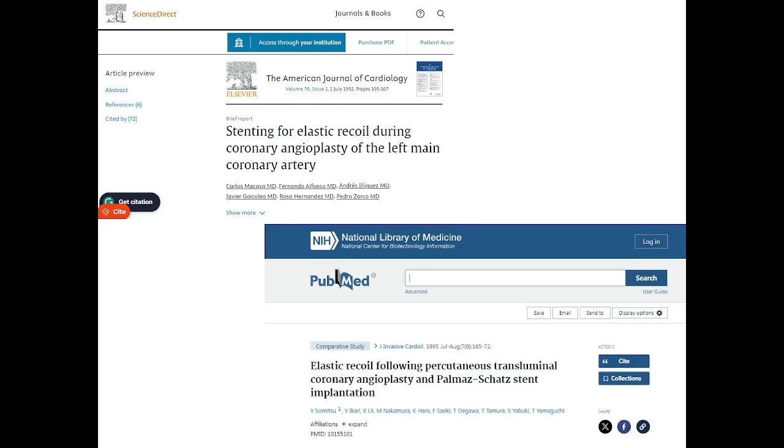When you have poor flow in STEMI situations like this, you don't know whether it's the proximal part that is obstructing or whether it is a no reflow phenomenon from extensive myocardial dysfunction. One thing you can do is put a microcatheter deep down, give some vasodilator and take a shot. If there's no runoff, this is no reflow, nothing you can do. But if there's runoff, then it's a proximal occlusion, and you have to deal with it with a larger balloon and stent. Intravascular imaging can also help in understanding what's going on.